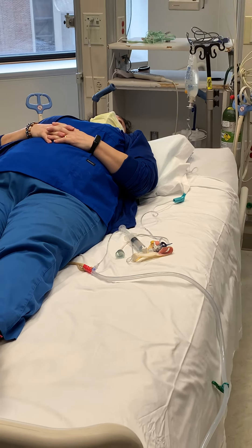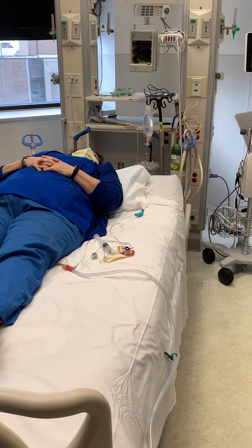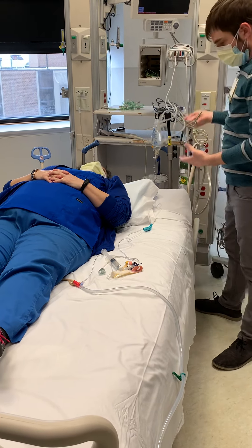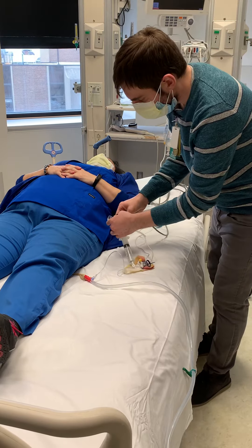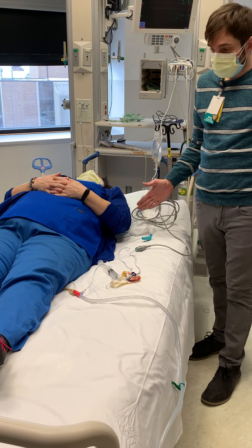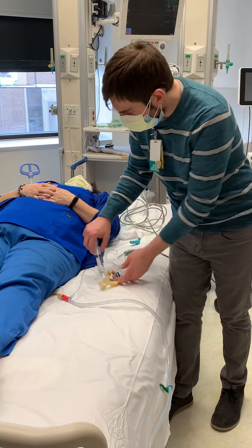Next, you need a red cable. We're going to measure pressure, so open your red cable for pressure. This is going to connect to your transducer. And instead of zeroing at the phlebostatic axis like we do with A-lines at the level of the heart, we're going to level it at the level of the bladder, since that's what we're measuring.